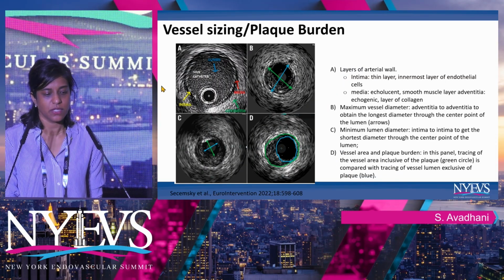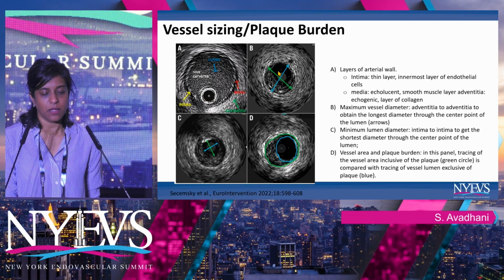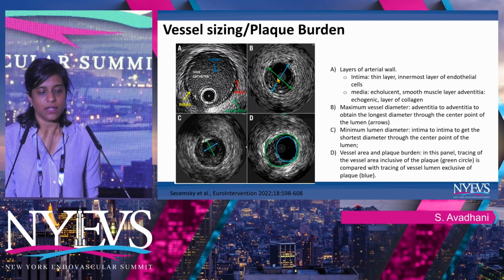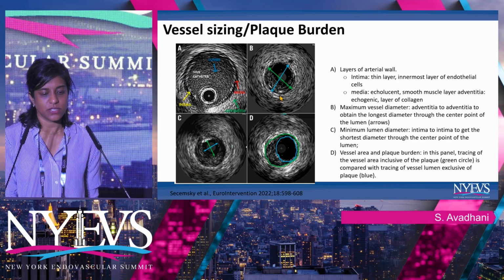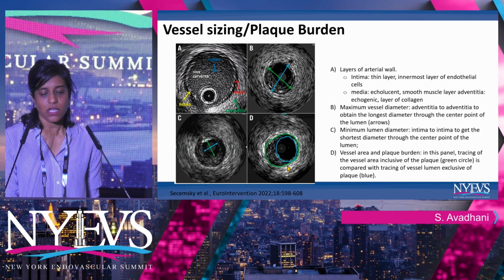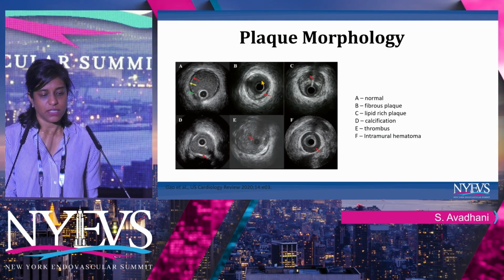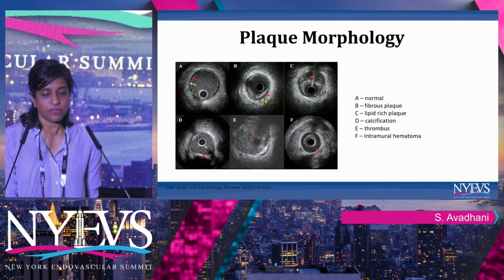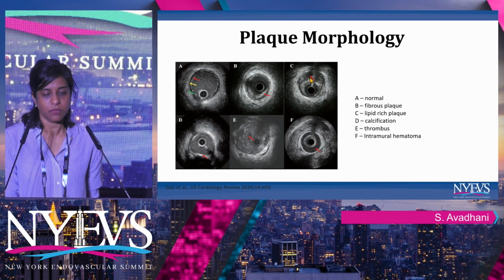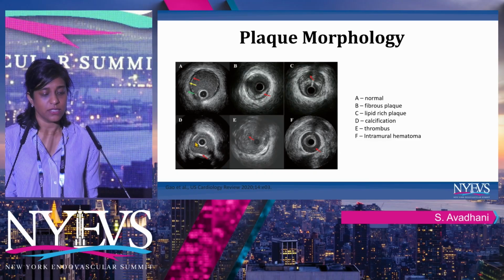In terms of pre-planning, it can help us figure out our landing zones, our distal healthy reference, proximal reference, our area of stenosis, and also plaque morphology, whether it's more fibrous plaque versus fibrofatty, or if there's any thrombotic component.